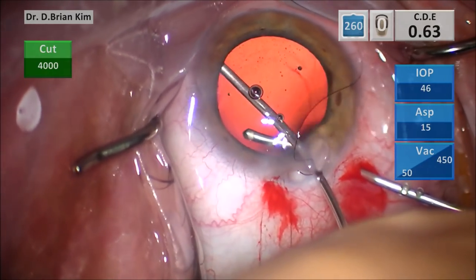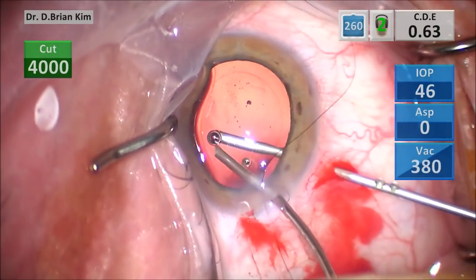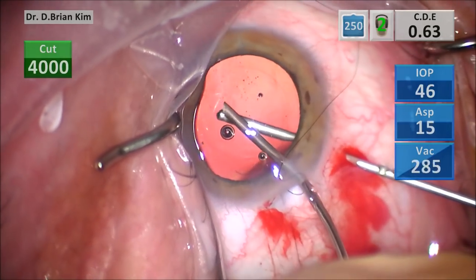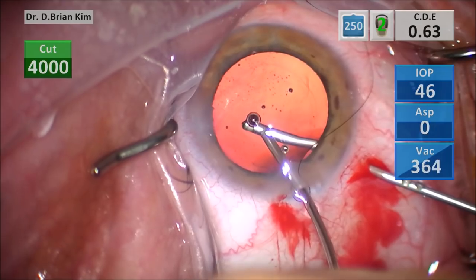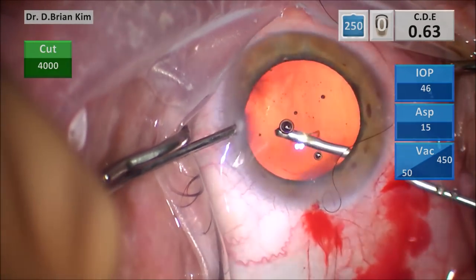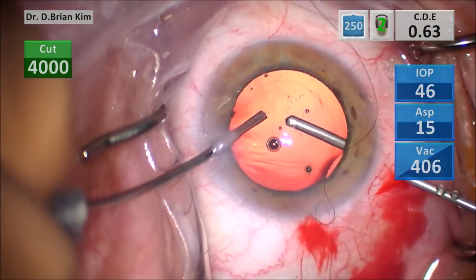Here I want to make sure that the paracentesis site that had the anterior fluid infusion doesn't have any vitreous as well. So I'm coming from a different approach and sweeping that left paracentesis and using the vitrector to remove any vitreous that might be going to my paracentesis incision. There's a little fragment there. Thankfully, the vitrector catches it and eats it. And I'm pretty confident there's no vitreous in the anterior chamber at this point.